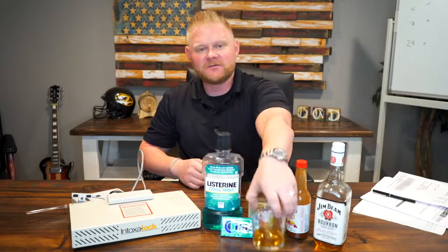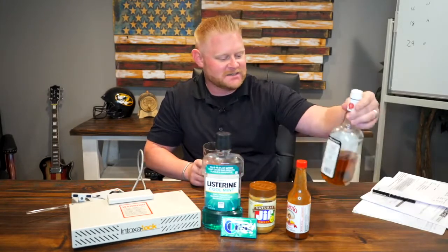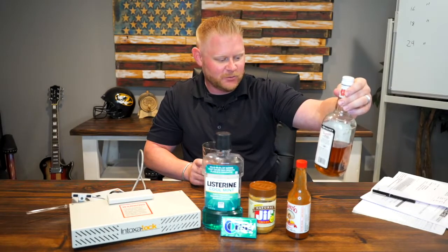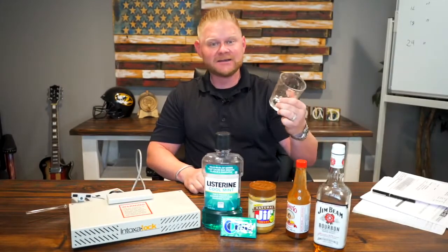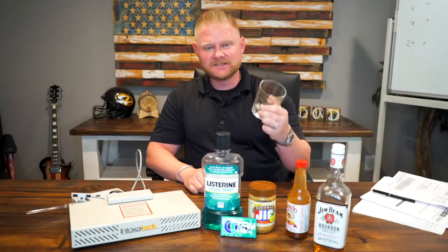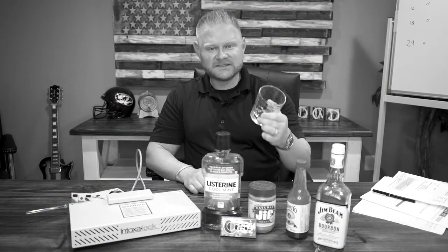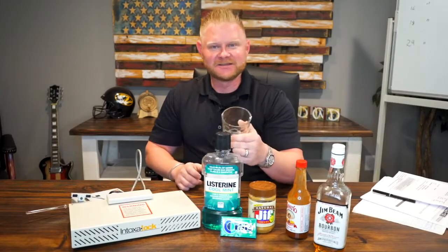We're gonna get to the test here real quick. In the interim, I'm going to go ahead and drink up. This is one shot of Jim Beam — an 80-proof Kentucky distilled bourbon, 40% alcohol by volume. Bottoms up.